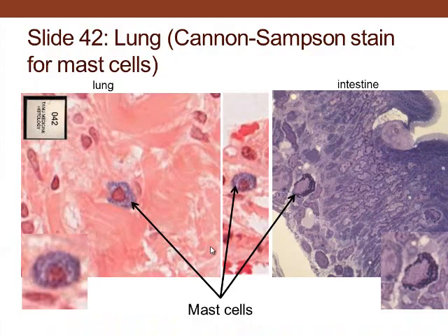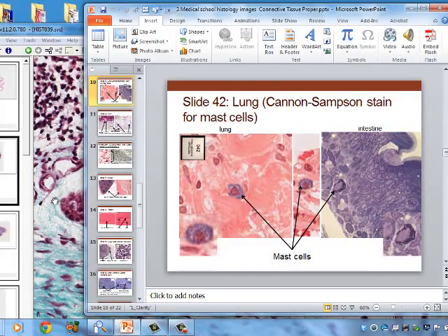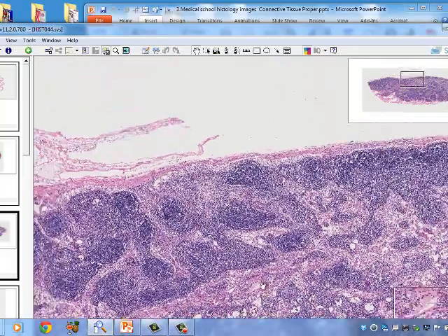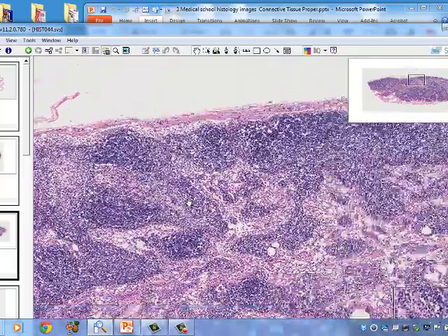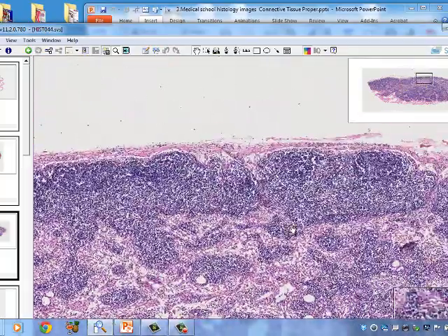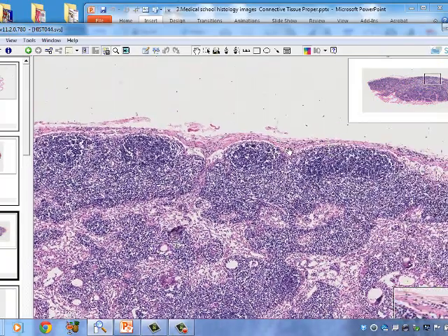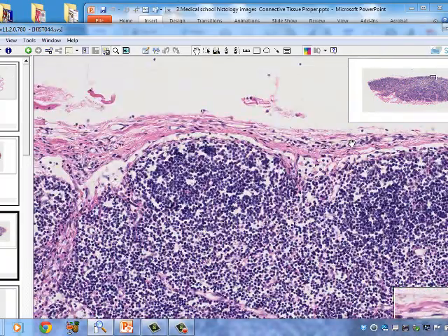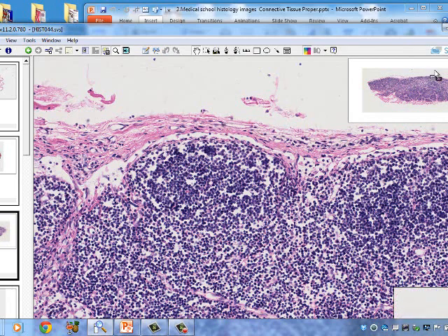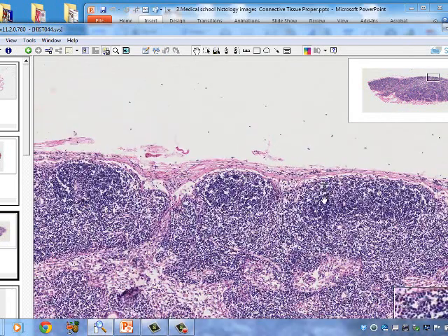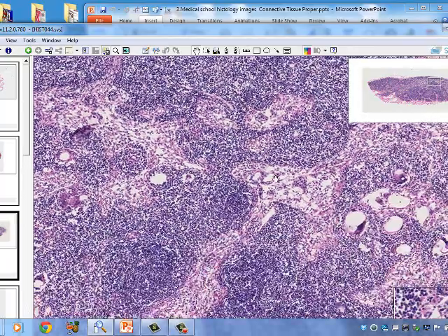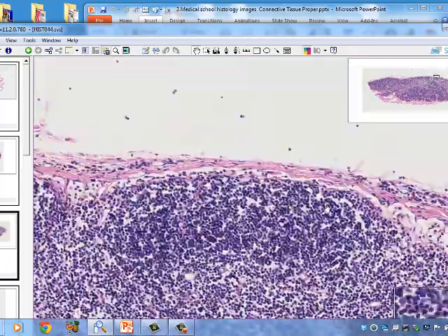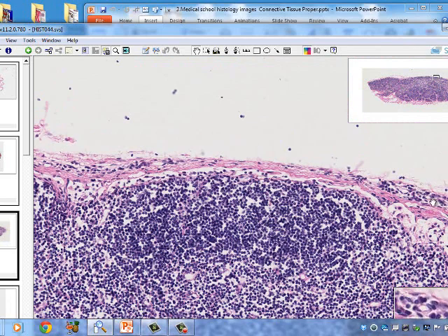The next image shows lymphoid tissue. We can see the capsule of what looks like a lymph node, a subcapsular sinus, and germinal centers inside. There is also a subcapsular space where fluid enters through afferent lymphatics.